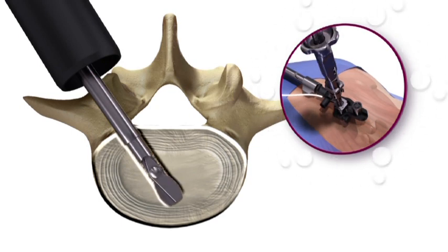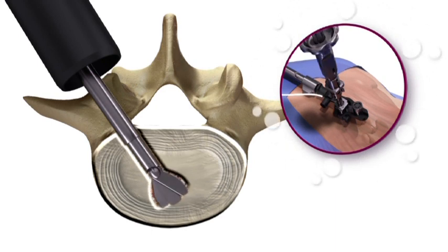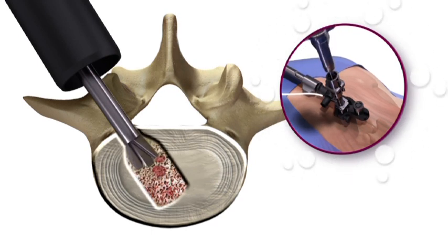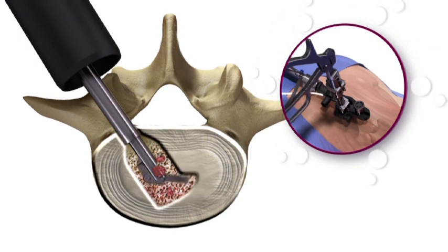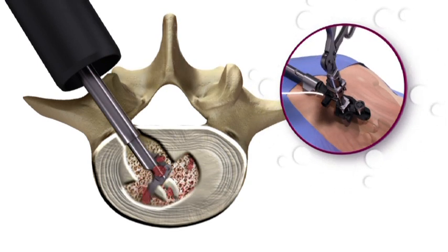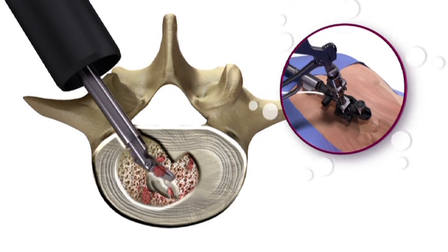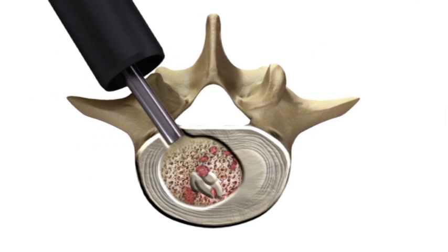An expanding shaper then widens the discectomy. The shaper is placed through the access portal closed, and then expanded by turning the adjustment knob located on the proximal end of the instrument. The shaper is followed by the backhoe articulating ring curette. Squeezing the handle on the backhoe causes the ring to articulate to the side of the central channel. The backhoe is used to widen the discectomy and decorticate the end plates.